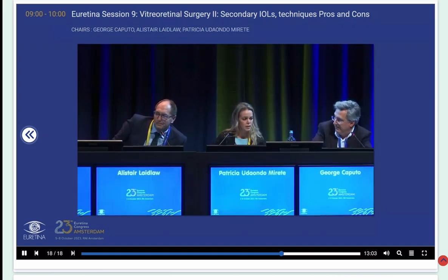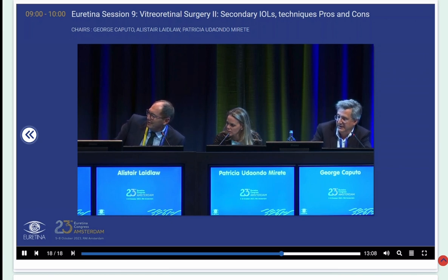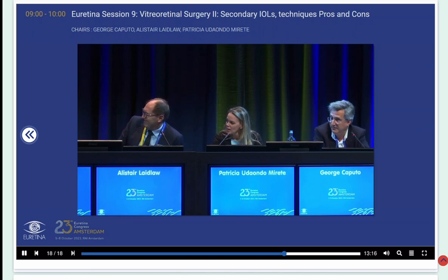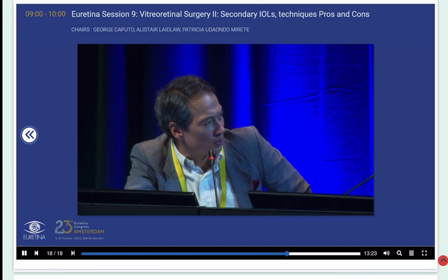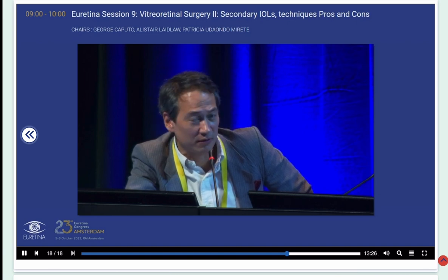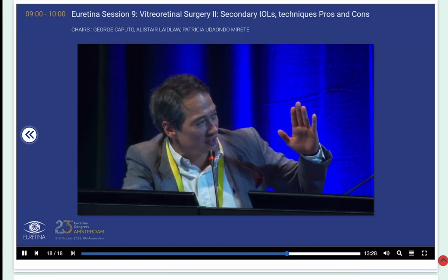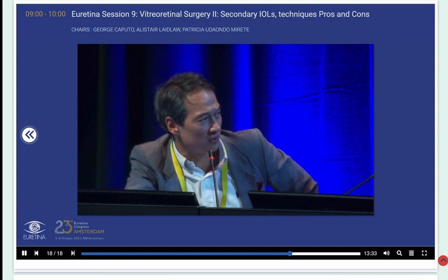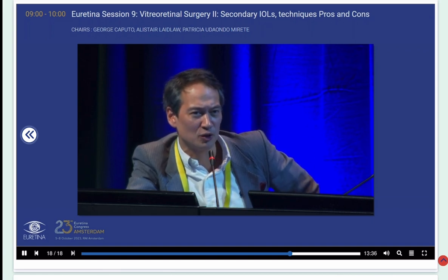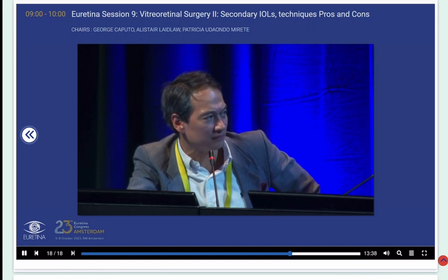So Kai, what's the learning curve, honestly, do you think, on the Carlevale lens? Because I didn't really get it very well. The biggest problem with the Carlevale for me personally is that I always call it the first-try bomb, because the first try goes well and you think, wow, and then after you've done 15 or 20, you start breaking the anchors and you get frustrated a lot. So I would say it's very steep, you land the first ones really well, and after 15, 20, you get into trouble with the anchor. I would say that this stops after doing 50 or 100. Okay.